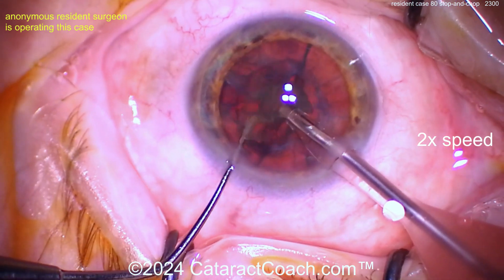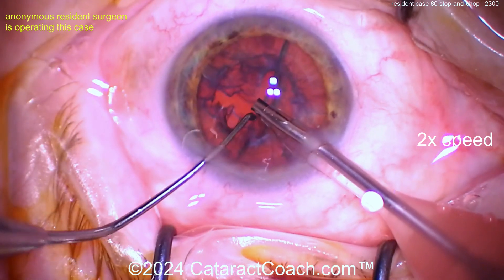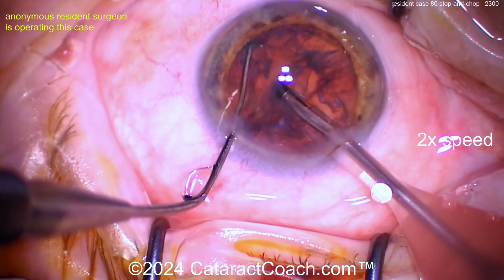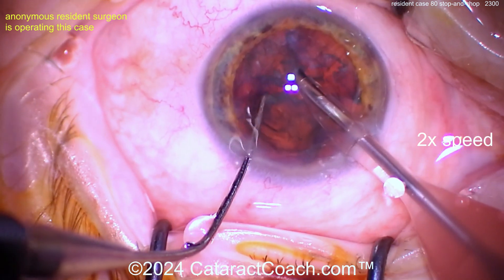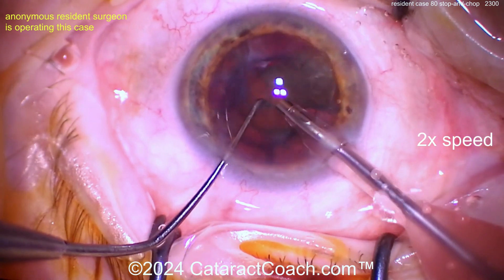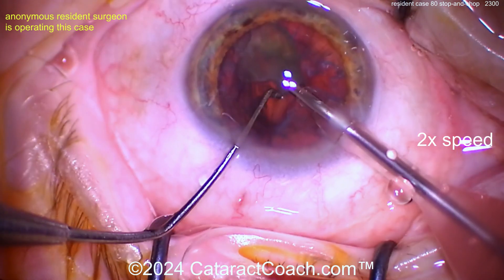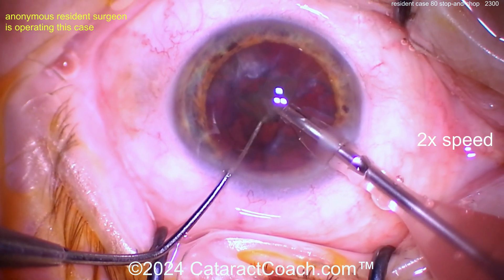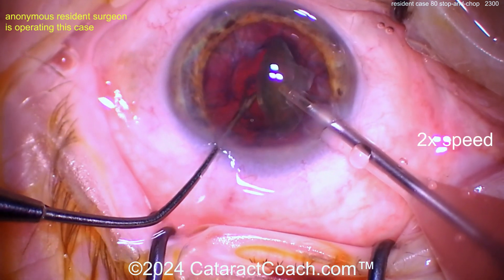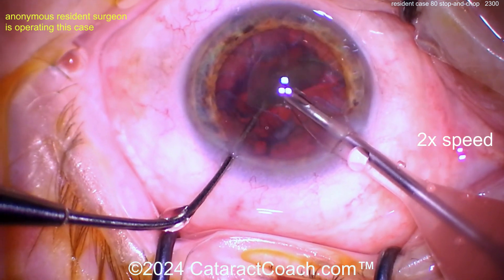There's a little bit of bounce in the AC — if so, you want to rethink your settings. Going to the other hemi-nuclear piece — chop it in half, nicely done. What settings would you want here? Probably a pretty high vacuum, at least 300 mmHg or more to hold the nucleus while you chop. A reasonable flow to keep things going — at least 30, if not 40 cc per minute. You don't need a lot of phaco power — it's not a real dense nucleus.